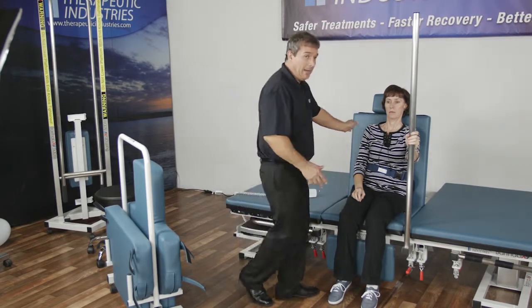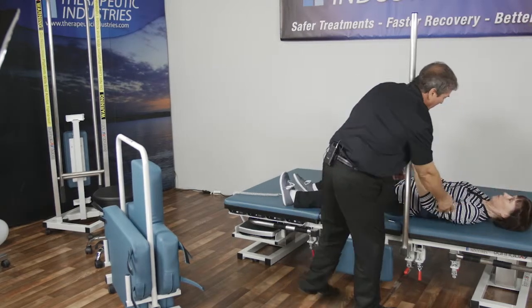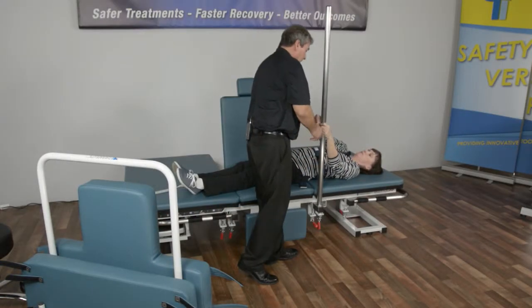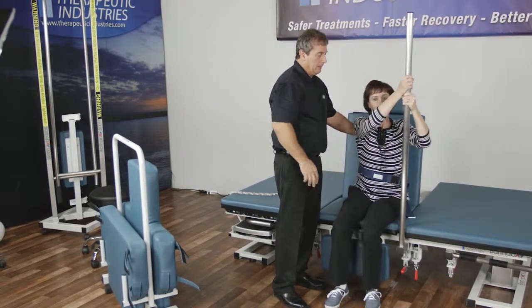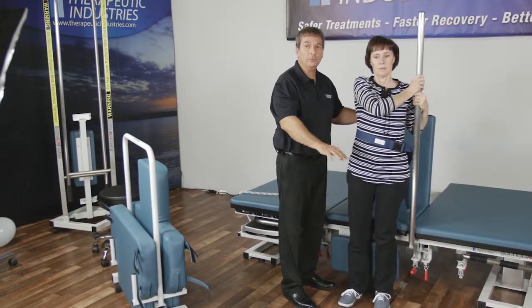You can also imitate a bed and they can reach up and use the pole to sit up in bed, then reach up and stand up and pivot over to their wheelchair.